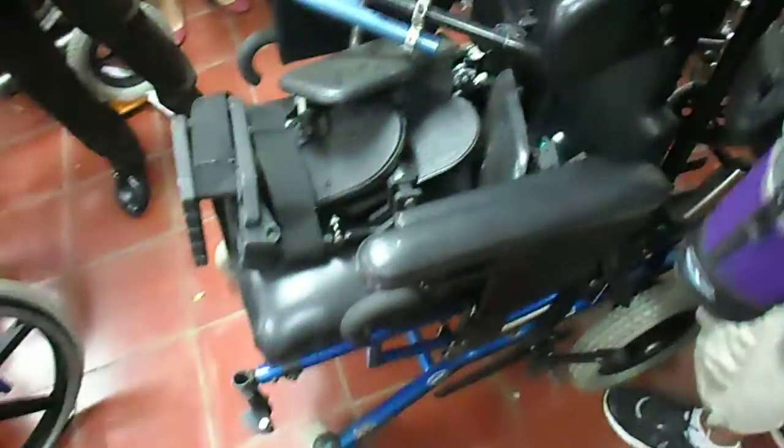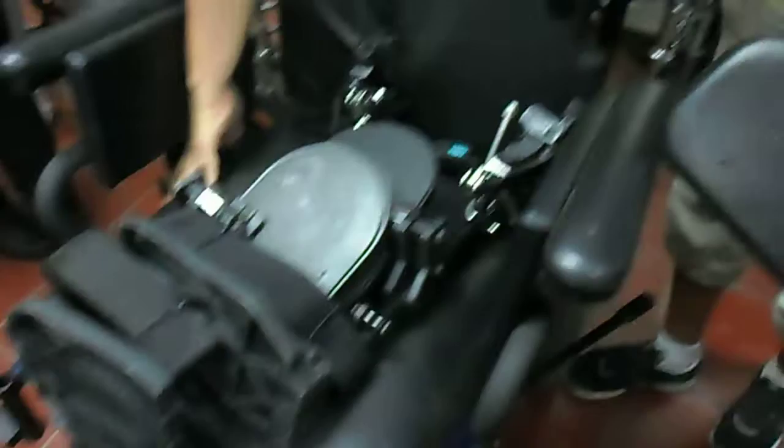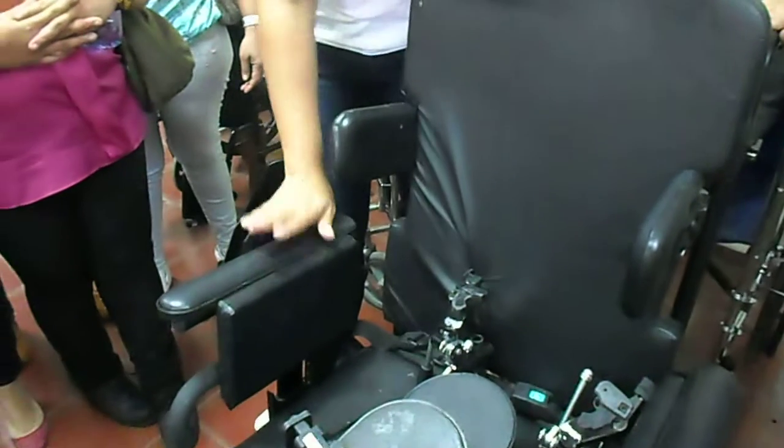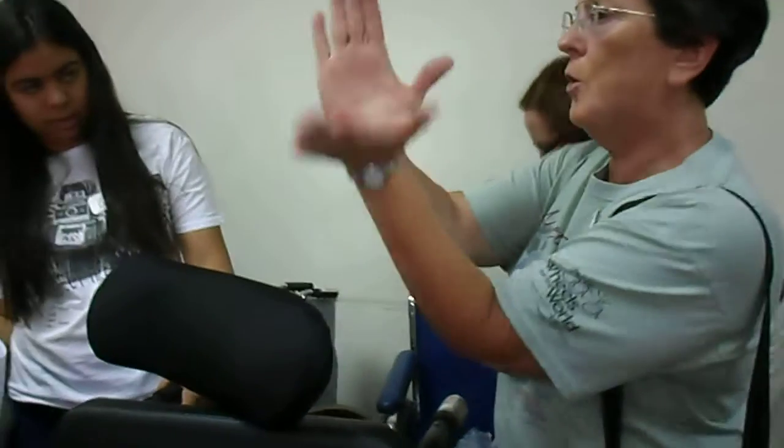If you look back here at some of these specialty chairs with the small wheels, this would be for someone that cannot push at all. We also have a lot of seating components in this chair — we've got a solid back and a solid seat. These armrests not only can be removed, but they can be moved up and down in height. This is also a reclined or tilt-in-space chair. It doesn't open up the seat-back angle; it tips the whole seating mechanism.